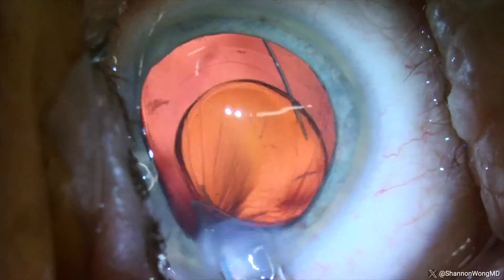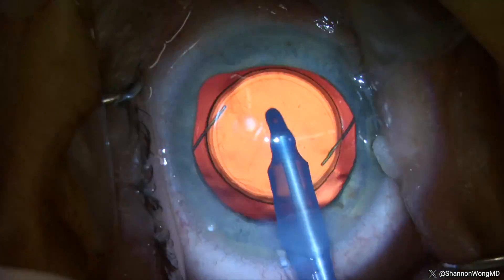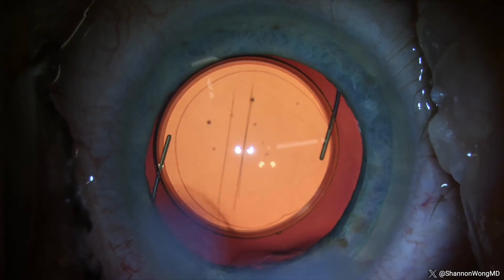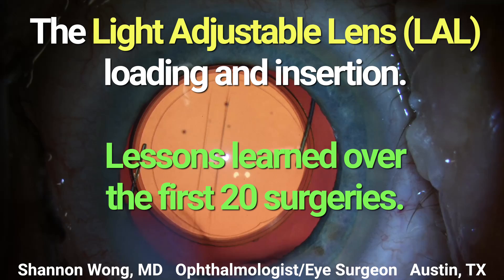The LAL appears perfectly centered at the conclusion of this surgery. After using the LAL for the past three months, our patients seem happy with their vision. The LAL does require extra time and care to load and deliver into the eye. If you're an ophthalmologist planning to use this lens, I hope you can learn from the tips in this video.